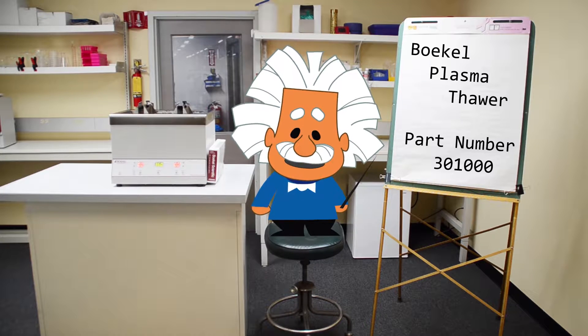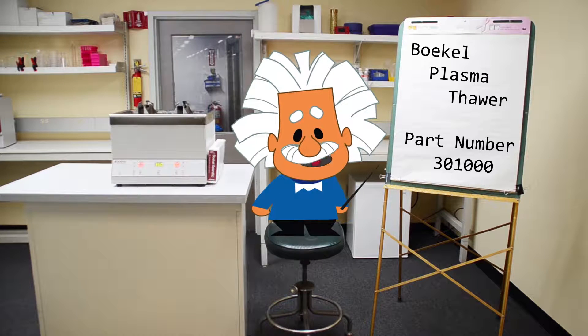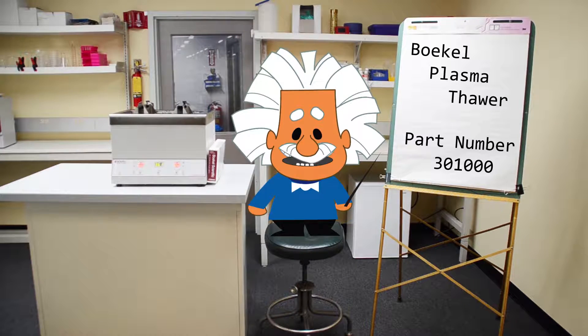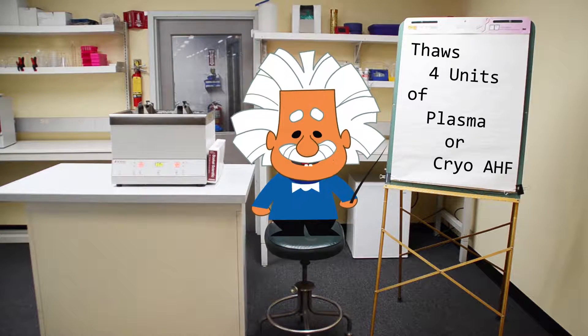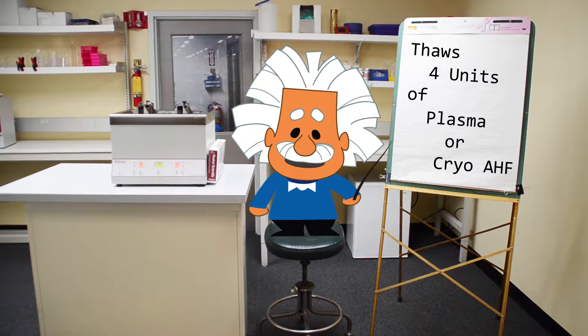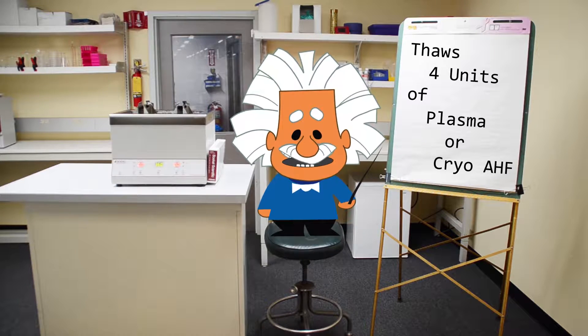Hello, and welcome to the product overview for the Boekel Plasma Thawer, Part Number 301-000, for use in blood banking facilities. The Boekel Plasma Thawer can thaw up to four units of fresh frozen plasma or cryoprecipitated antihemophilic factor for future infusion into a patient.